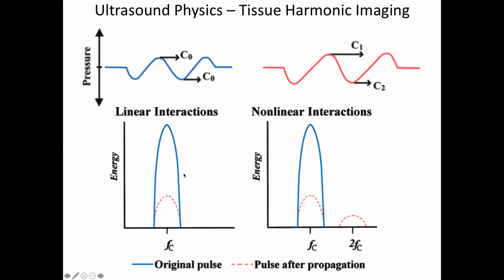And so what gets reflected back? What you see at the transducer, because it's done a round trip through the tissue, and this type of distortion has had time to evolve, is the primary component, which is obviously the primary frequency here, plus these harmonics, in order to create this shape.